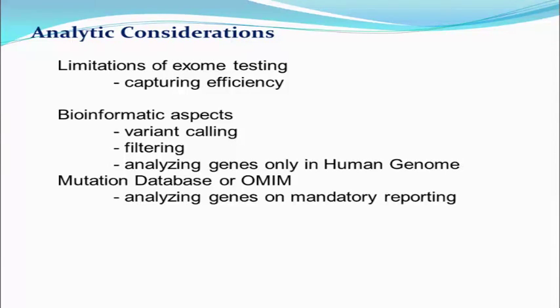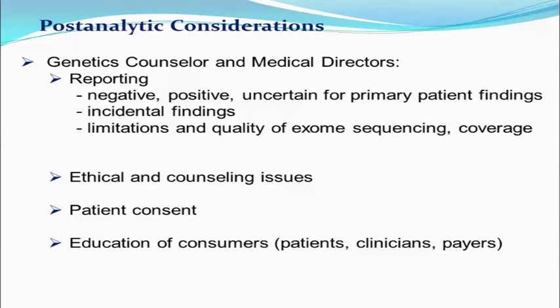Then there is a lot of evolving in the data analysis. I'm not going to go through the details. And post-analytically, once the report is ready, we follow up with the physicians to discuss the results and the limitations and quality of exome sequencing.